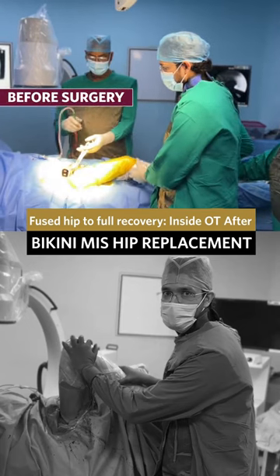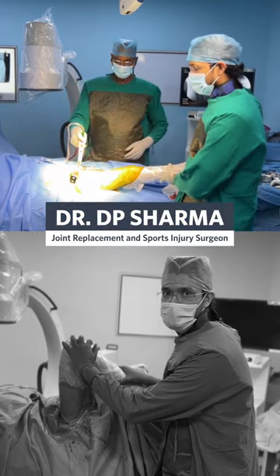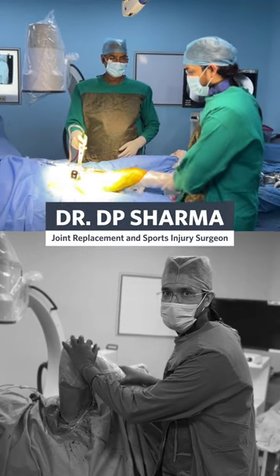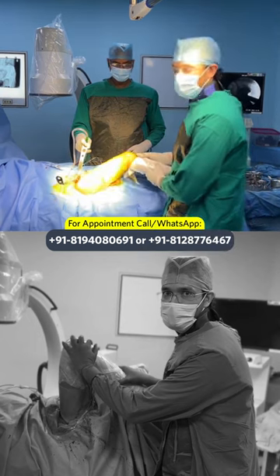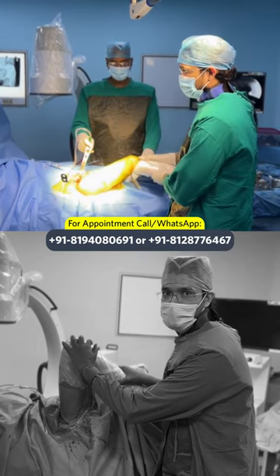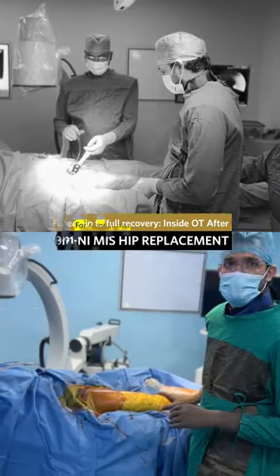We are now seeing a case of MIS bikini technique. The patient has a fused hip with no movement — flexion is restricted, not going beyond 20 to 30 degrees, and rotations are restricted. We will check it after our MIS bikini special technique.